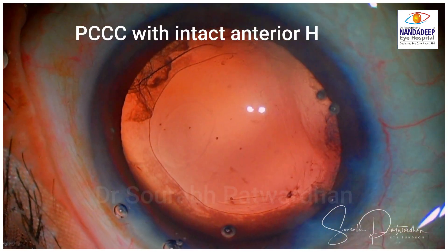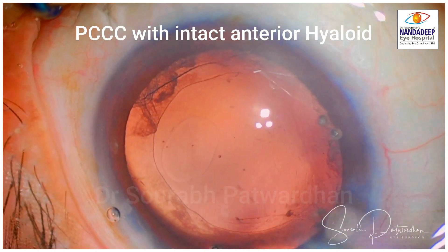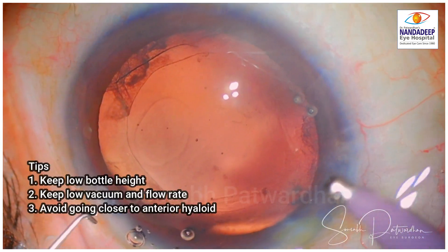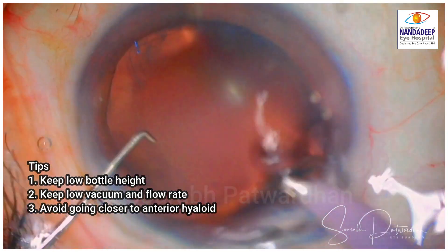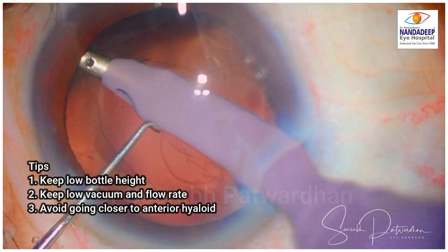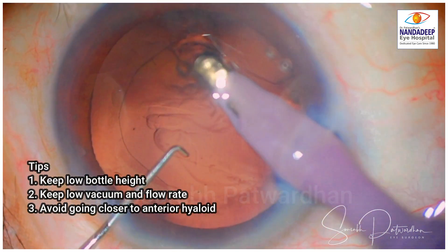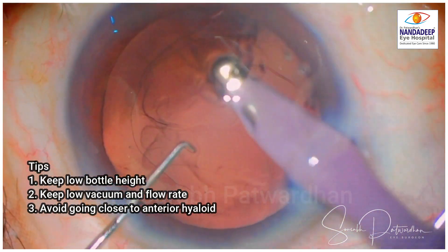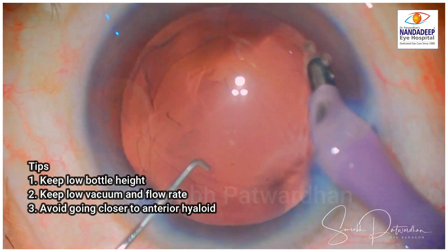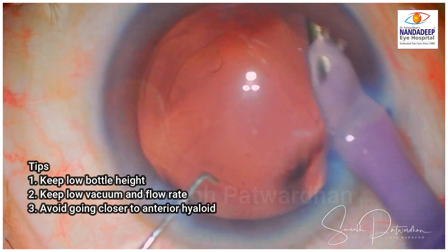PCCC is really easier than what we think. Now what I have is a complete posterior capsule rhexis with intact anterior hyaloid. I can use regular coaxial IA for removal of the remaining cortex. Always keep the bottle height low — you don't want to rupture the anterior hyaloid. Keep low vacuum and flow rate and avoid going closer to the area where the anterior hyaloid is exposed.